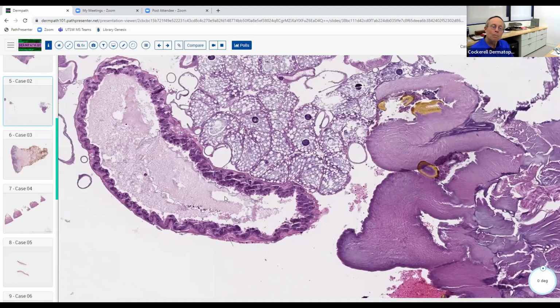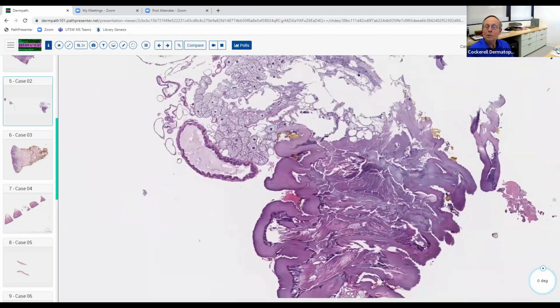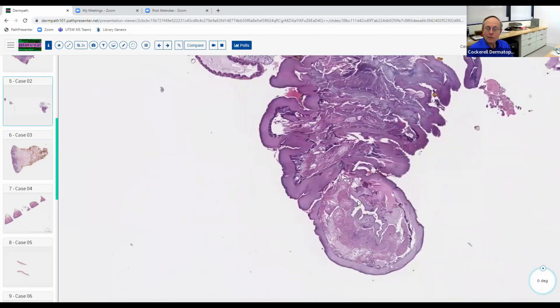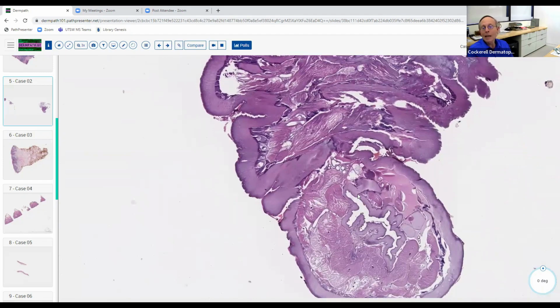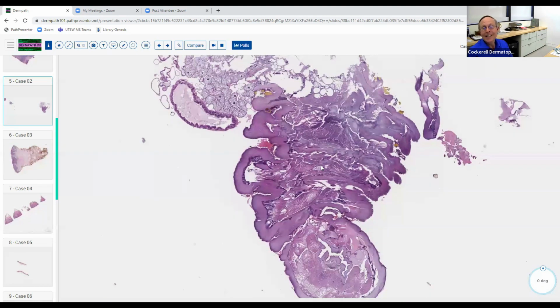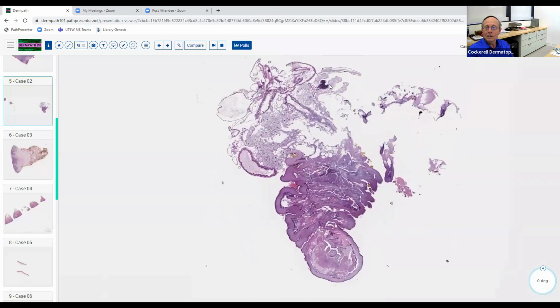And do you know by chance what type of arthropod it is by looking at these little structures, for example? My best guess was a maggot larva, like myiasis. Yes. I call it myiasis, but Dr. Rapini, I think, says that's the right pronunciation. He may be right. I don't know. So that's exactly right. This is a little fly larva.